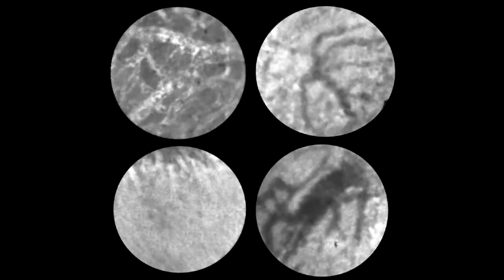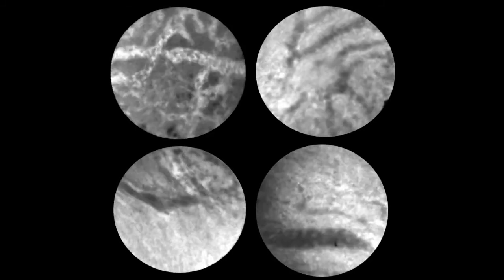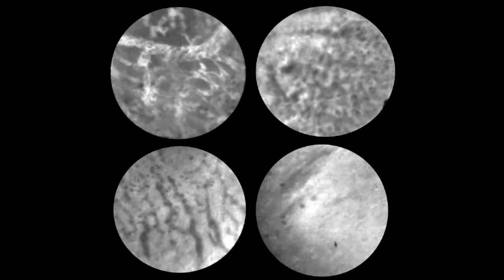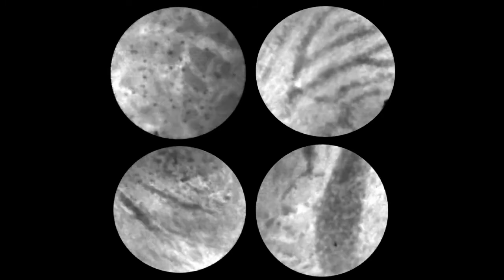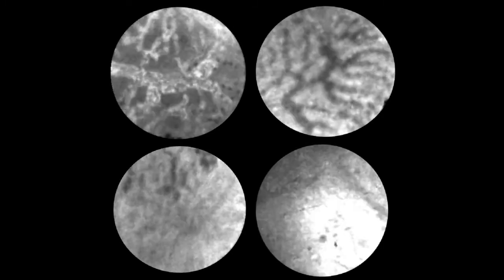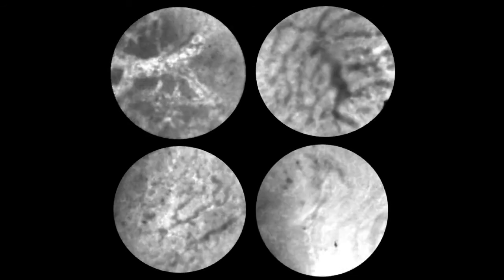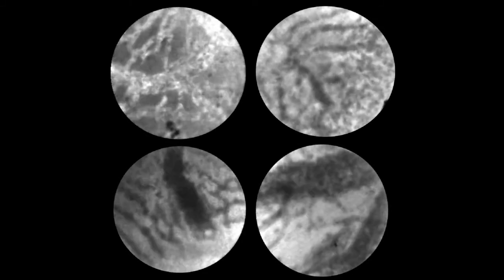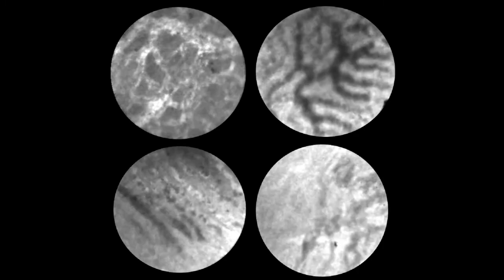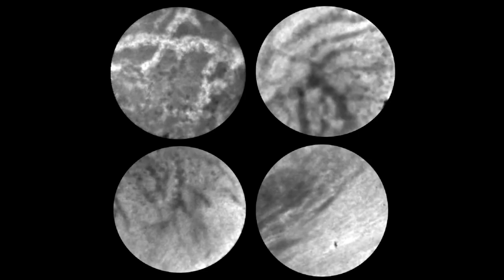Here are 4 different patients with serous adenomas showing the fern pattern of vascularity. These are essentially the capillaries which occupy the entire cyst. When we do endomicroscopy, these images move very quickly and we get to see this beautiful pattern of blood vessels. Essentially, there is a central blood vessel from which other blood vessels branch off. You get to see RBCs floating within these blood vessels, or sometimes blood vessels packed with RBCs.